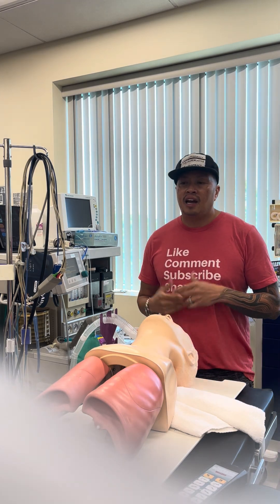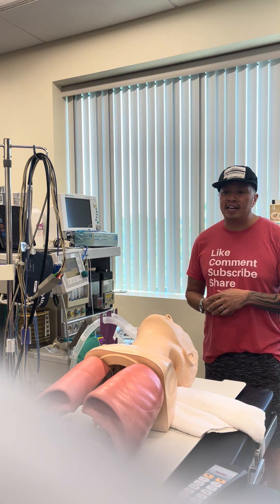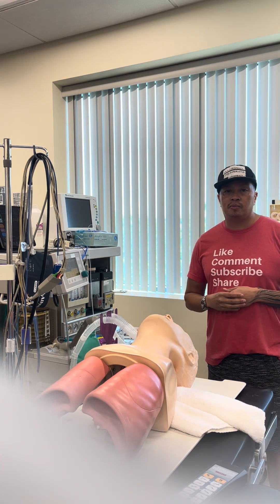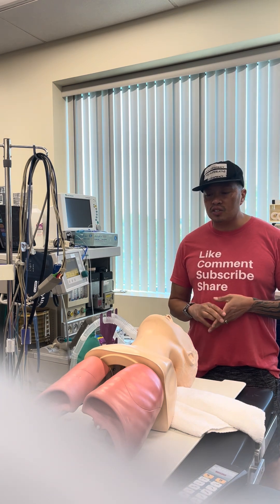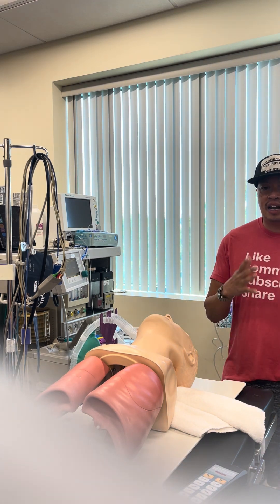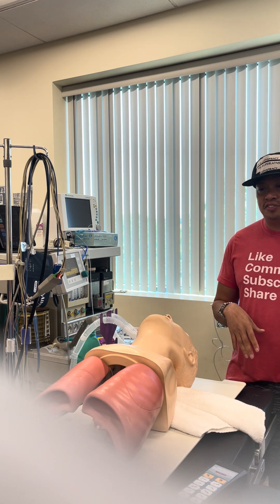Okay, so the patient comes in. 'How are you doing, sir? Welcome to the OR for the first time. I'm Howie, I'm your CRNA. Can you repeat to me your name and your birthday again?' All right, Mr. Joe Smith, thank you very much. So I'm going to have the gurney come up all the way to the operating room table, and then when you get a chance, just scoot on over.